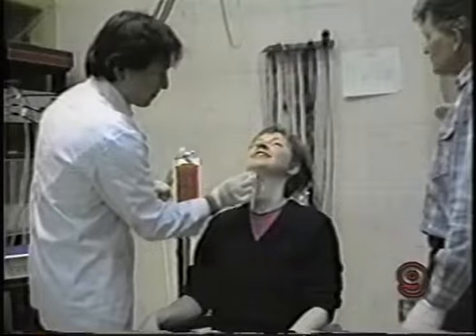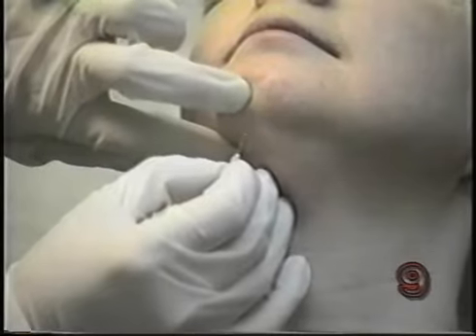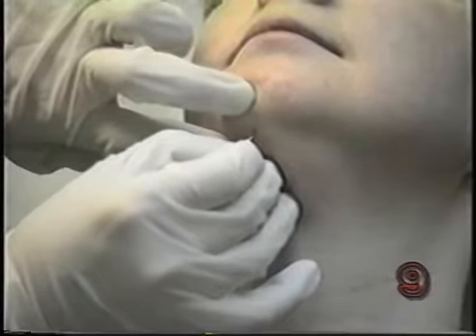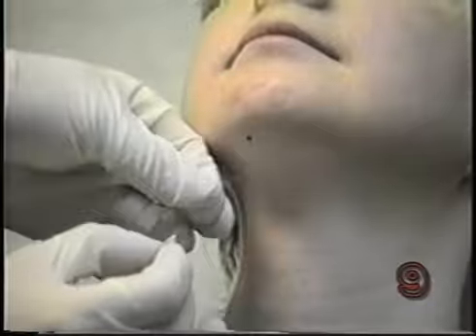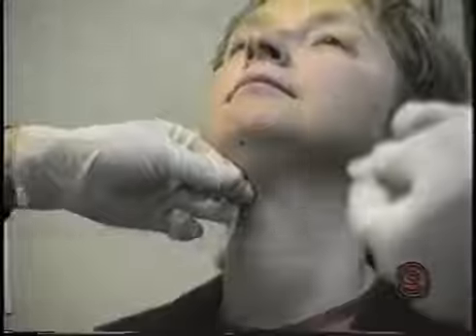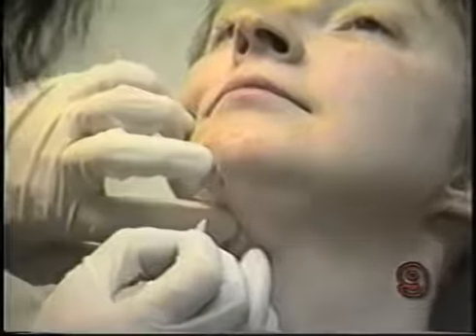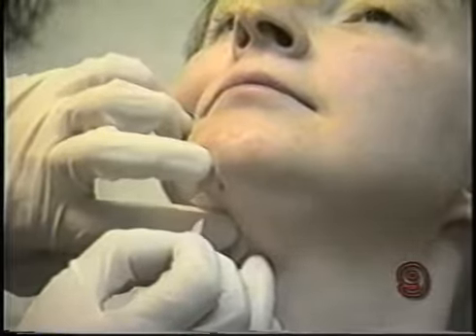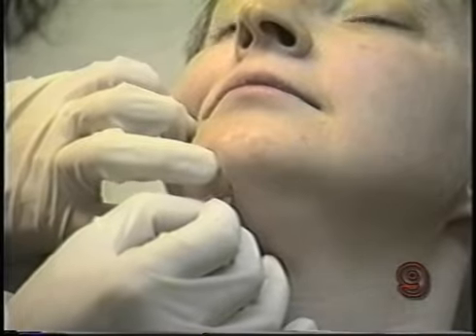In this scene, hooked wire electrode insertion into anterior belly of digastric muscle is being shown. After sterilization, a monopolar electrode is inserted through the neck surface. A second electrode is being inserted into the same muscle about 1 centimeter away from the first insertion.